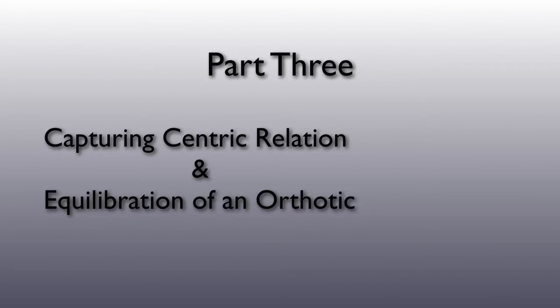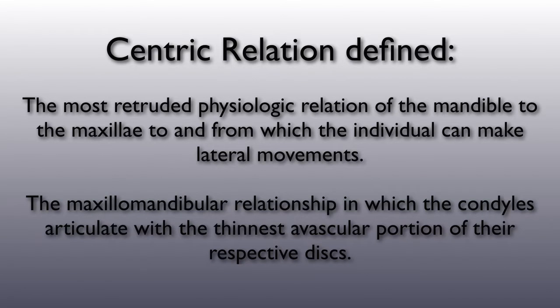In this Part 3 video, we will discuss techniques for capturing centric relation, and then equilibration techniques using all the previous information to adjust an orthotic. In the glossary of prosthodontic terms, there are unfortunately several definitions of centric relation.